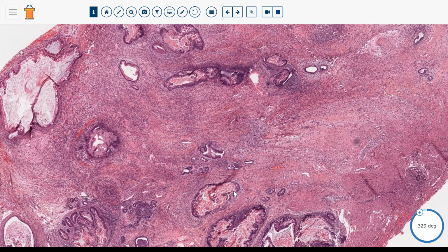But just to point out, rarely you can have a benign teratoma in an adult patient, and you have to use those very strict criteria, that you can have none of those things. Often those will be in the form of a dermoid cyst, so a squamous-lined cyst with glands draining into it, or an epidermoid cyst with just a squamous-lined cyst and no other elements.